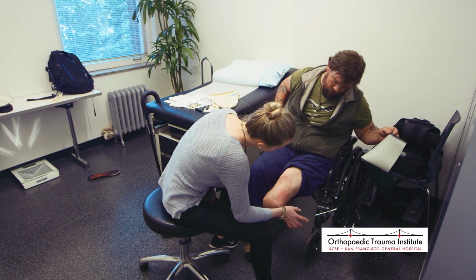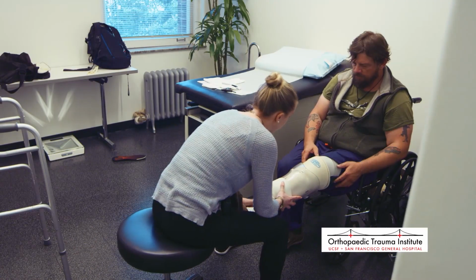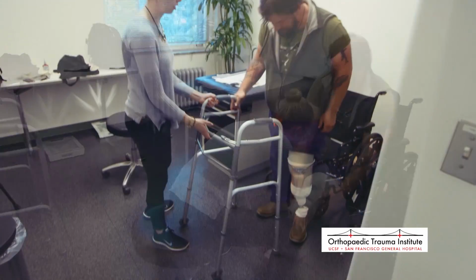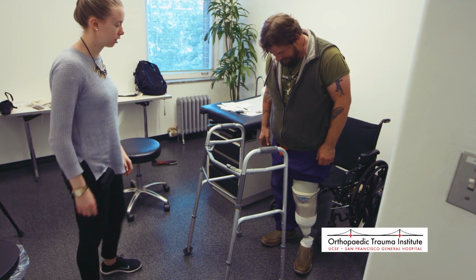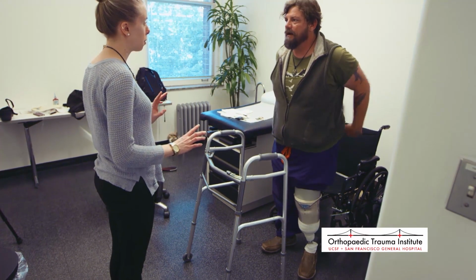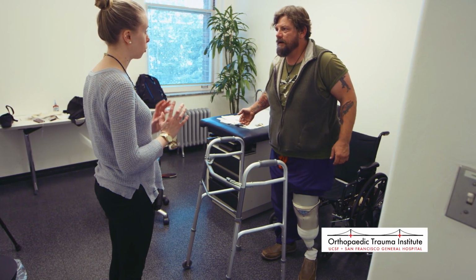This ideal socket fit can be difficult to balance when sensation in the residual limb is limited, or if the wearer experiences significant volume changes in their limb throughout the day as a result of medication, diet, and exercise. Working with your prosthetist is key in establishing a comfortable socket fit.